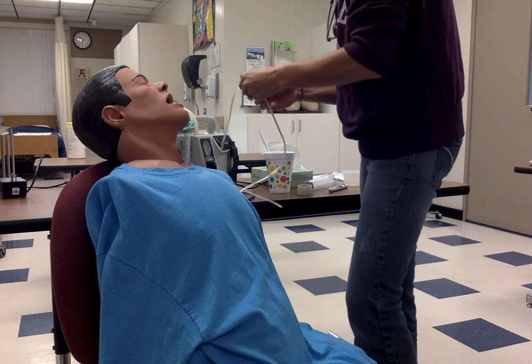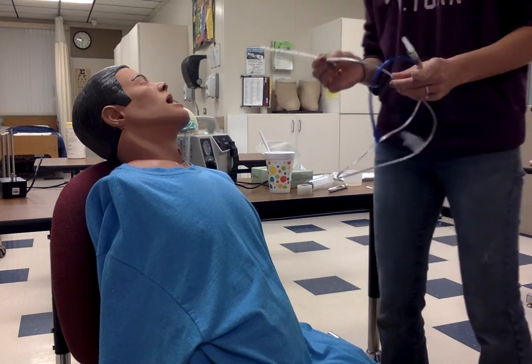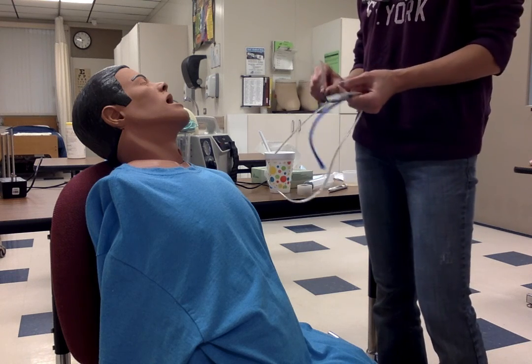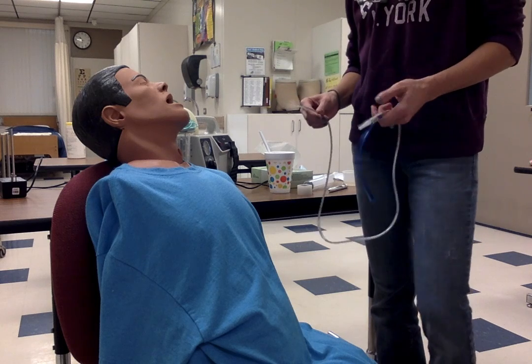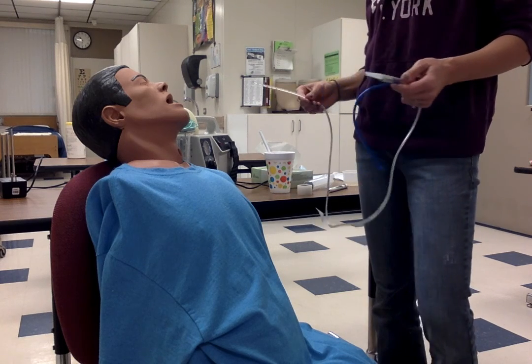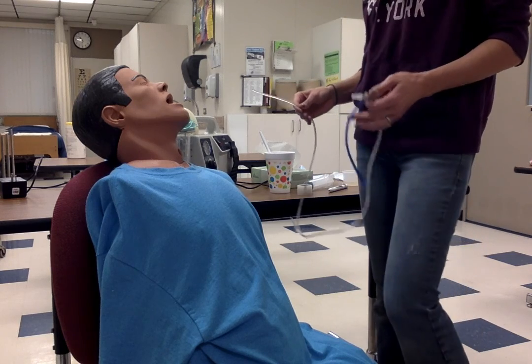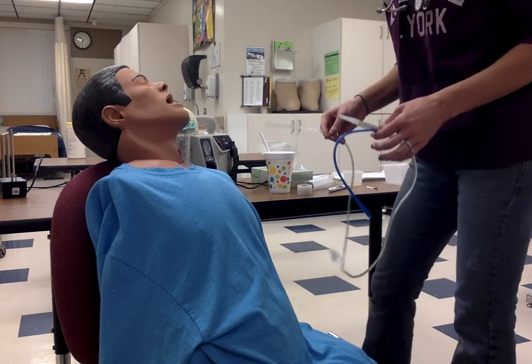There we go. Okay, and it's important to note that this is not a sterile procedure. This is a clean procedure. If you think about this as going into the stomach, of course we want to keep it as clean as we can. We wouldn't want this going on the floor. We wouldn't want to be touching it or anything, at least as little as possible. But just note that this is not a sterile procedure.